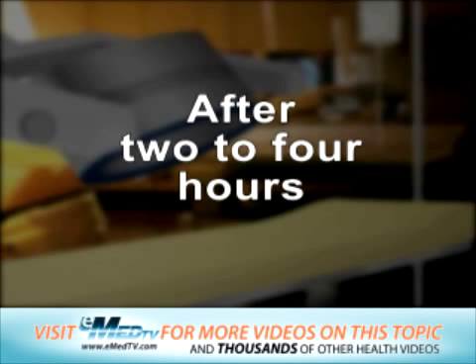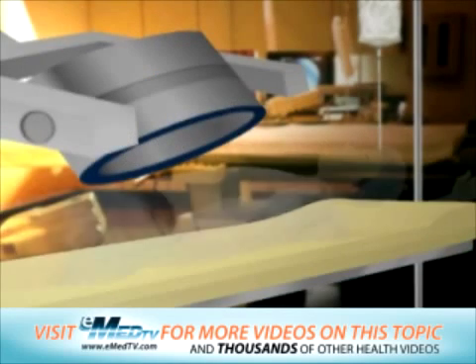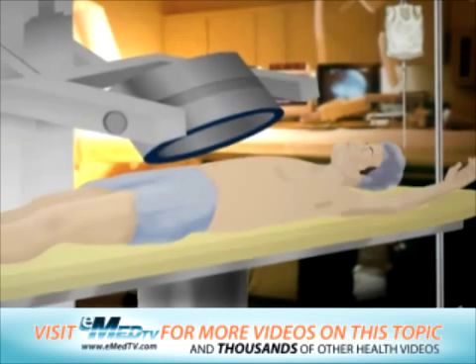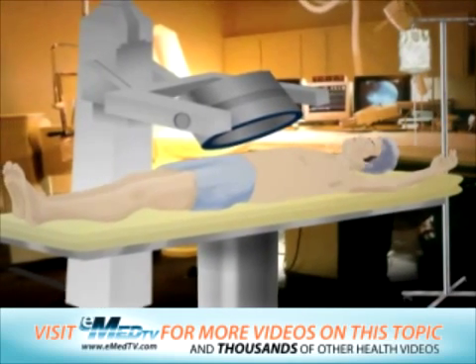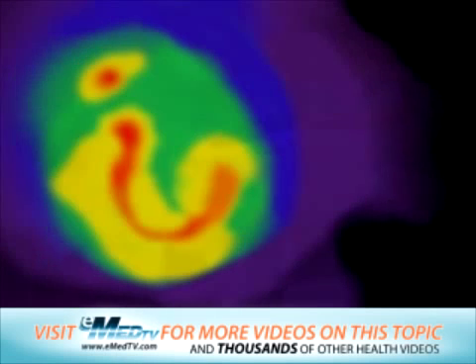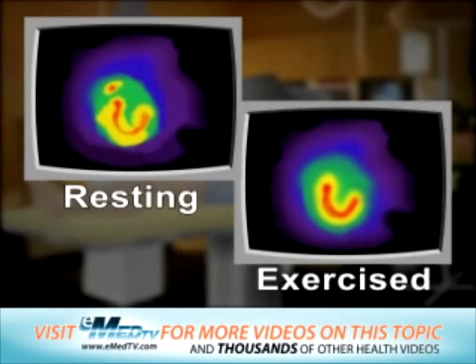After 2 to 4 hours, you will be asked to return. You will not need to exercise at this time. You will only need to lie down on the imaging table again while a second set of scans is taken of your heart at rest. These scans are then compared to those taken during the first scanning session while your heart was exercised.